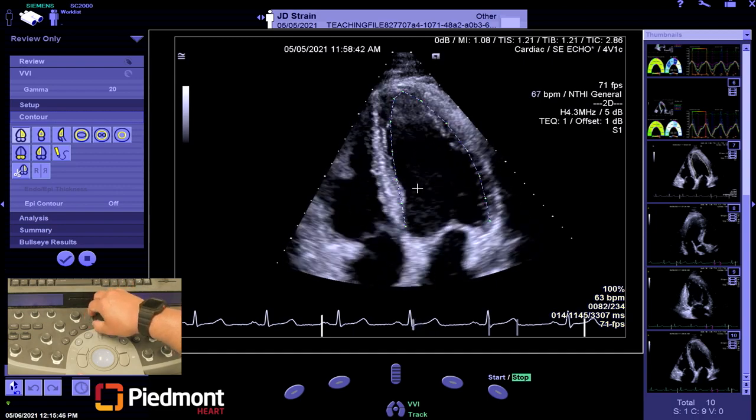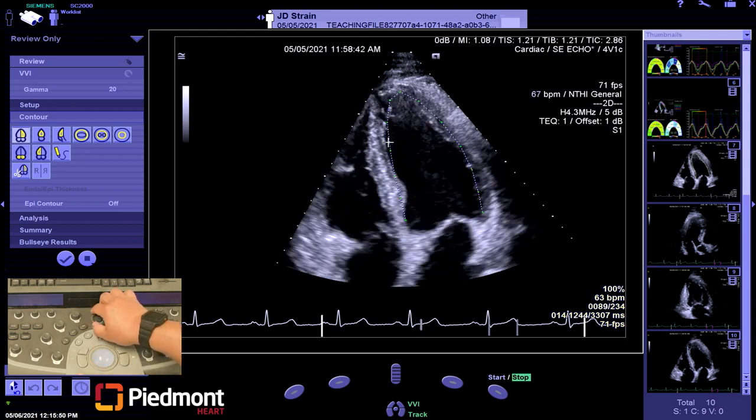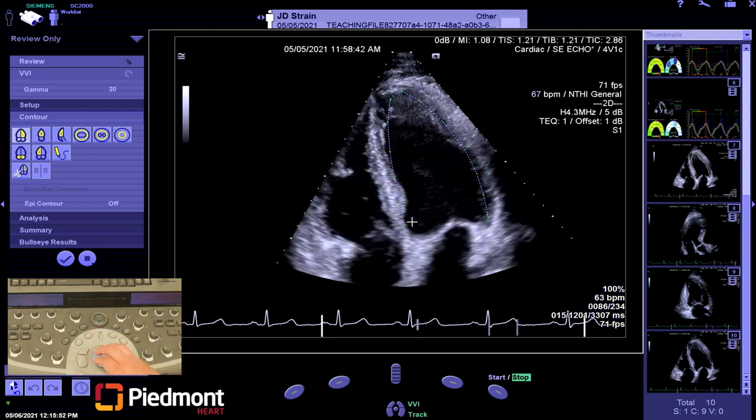And you can really see, even though it's slightly off from the endocardium, it actually is moving fairly well. But we'll make some subtle adjustments here, bringing this point out, and that's a simple right click on the green dots, and then we'll bring these slightly out, so it's a single click to grab, and then just a slight movement. Single click to grab and slight movement.